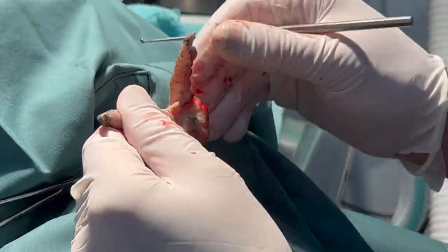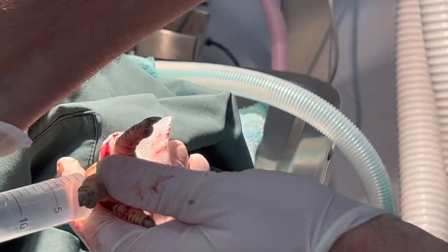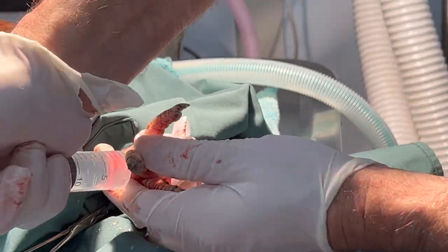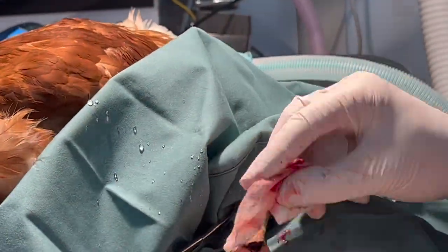I'm hoping that the two wounds communicate — if I get them to connect it'll make flushing much easier. I'm sure they'll connect. Are you using 4G or 5G to communicate? Well, because it's a chicken and not a mammal, it's usually 3G — mammals would use 4G.